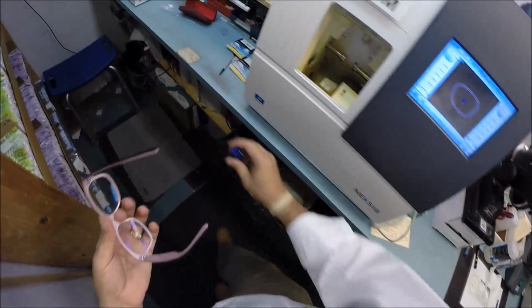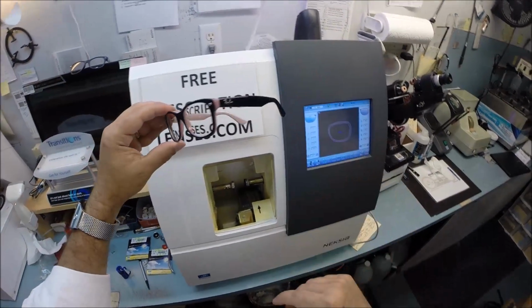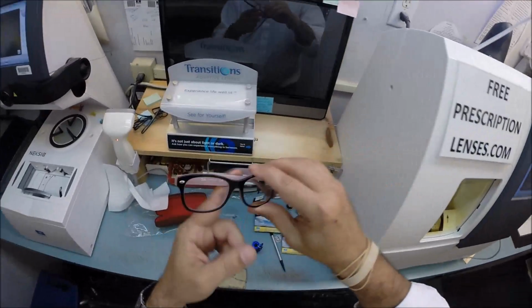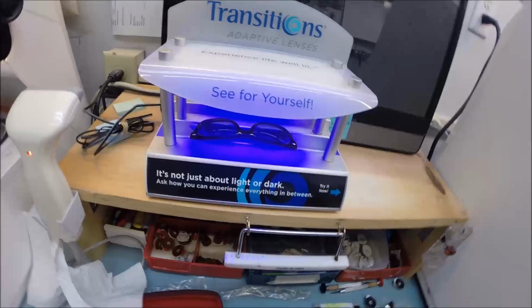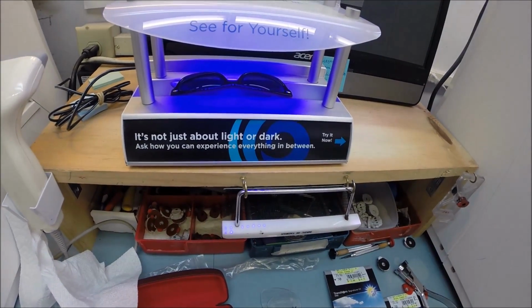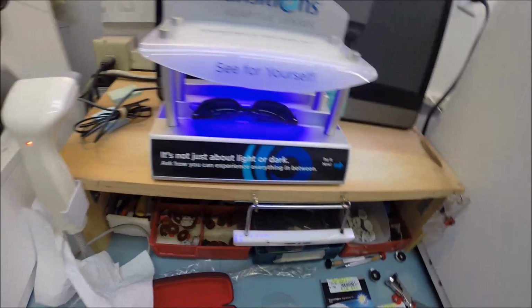So, this is what your lenses look like clear. I'm going to go ahead and activate them, which means I'm going to expose them to a strong burst of ultraviolet light, like when you go outside, and I'm going to turn them dark. So, as you can see, all transition lenses will turn dark. It takes about 30 to 45 seconds for them to turn dark when you go outside, a little bit longer when you come back inside, 45 seconds to a minute 15 when you come back in from recess.